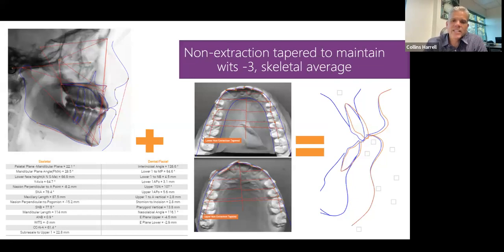Okay. Interestingly, she's a little bit mild skeletal class 3, given a Wits appraisal of -3. And my eyes are going, so these numbers are small for me, but an A and B measurement of about 0.9, almost 1. So she's a little mild skeletal class 3 with some mild dental class 2. She's skeletal average, so she has average muscle strength, and the teeth should move well if she wears her aligners well.